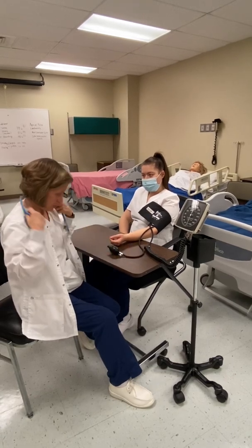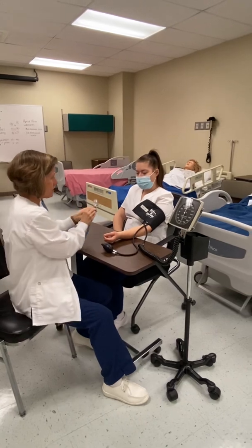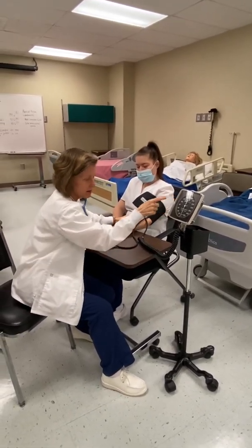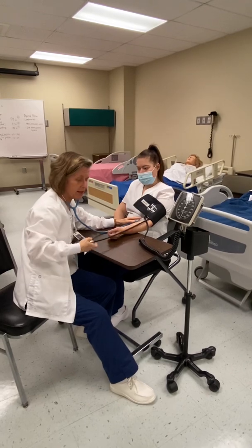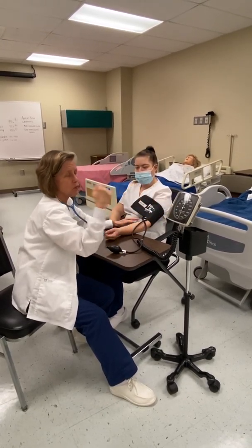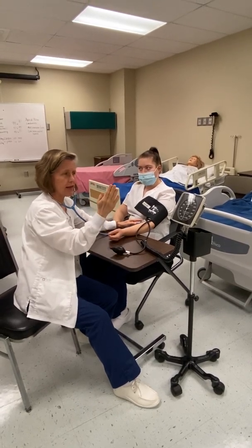Now I'm going to do the actual blood pressure with my stethoscope. I'll put the diaphragm of my stethoscope right over the brachial pulse I palpated earlier. My palpated systolic pressure was 110, so I'm going to pump it up about 30 above that to give a little wiggle room. When letting the air out of the bulb, you want the needle to go down one to two lines per second, which is two to three millimeters of mercury per second. You'll need to practice to get that flow right — too fast and you'll miss the systolic, too slow and the needle can get stuck and bounce.